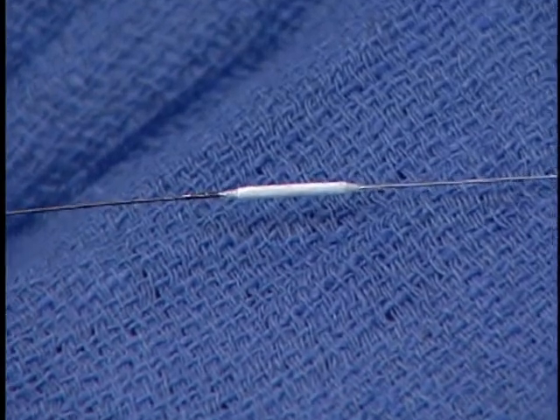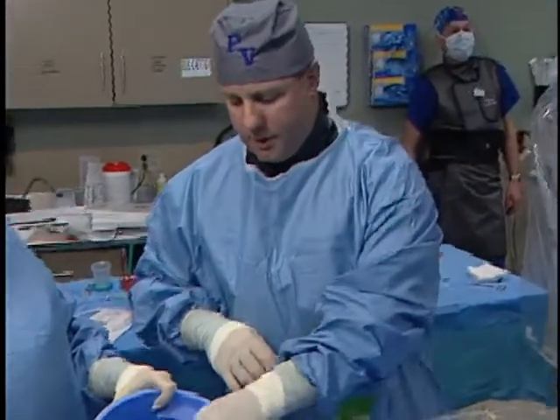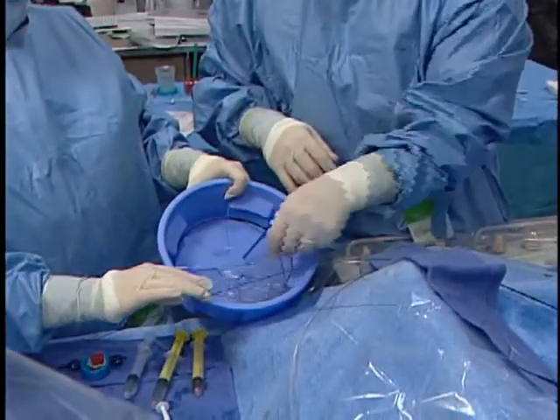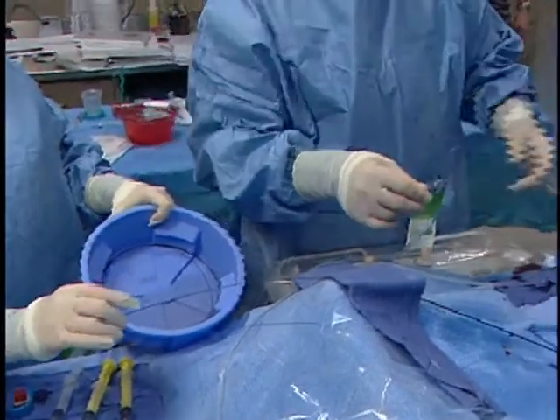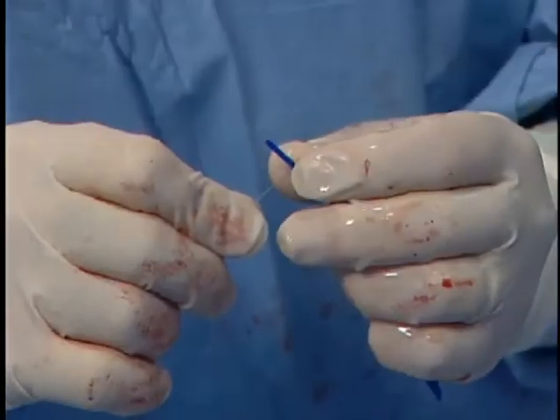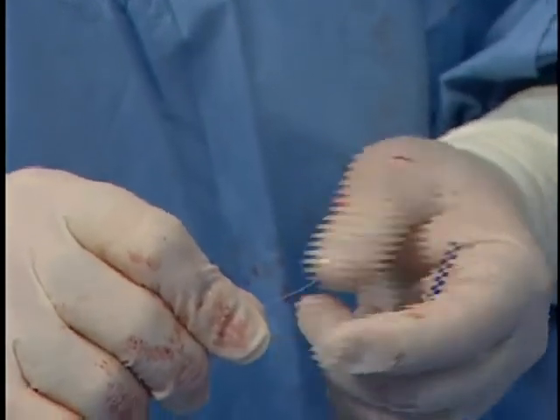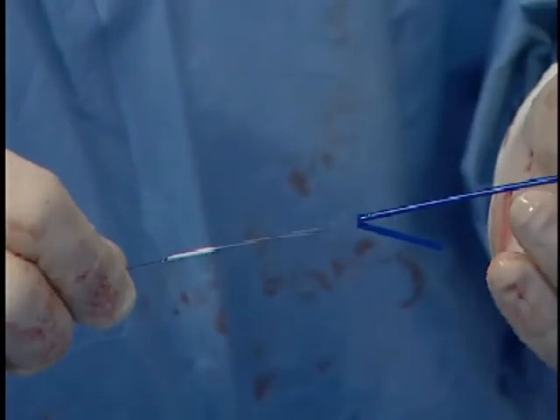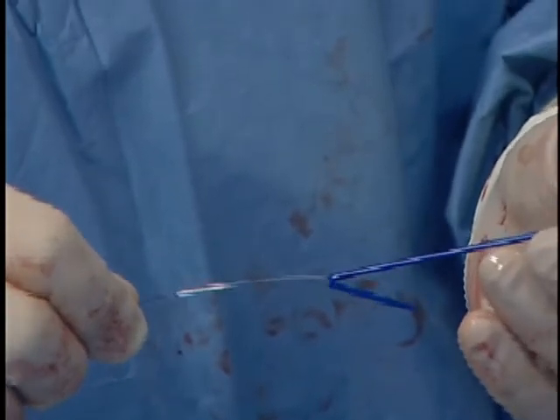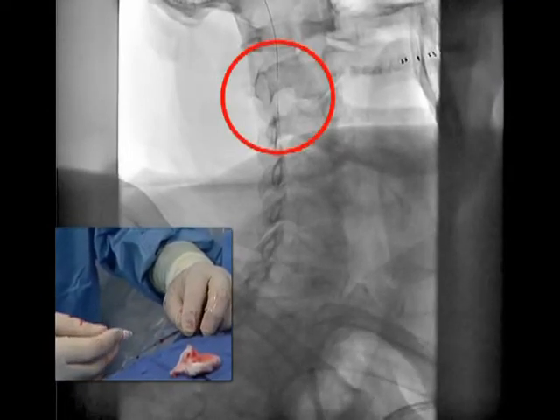Right out of the box it has a very low profile and is very easy to deploy. This is on a 014 wire — standard coronary size wire. To prep this, you just dip it in some water and that's really about it — it's ready to go. We're going to take our introducer and put a little shape on this. There's not much tortuosity here, so I'm going to leave this relatively straight without a big curve on it. We're going to introduce this into a peel-away sheath and advance the filter across the lesion.